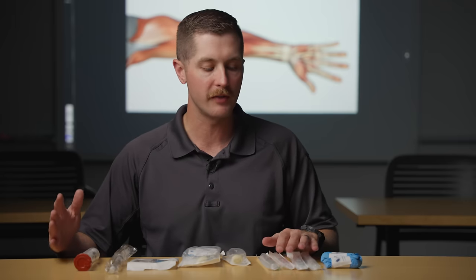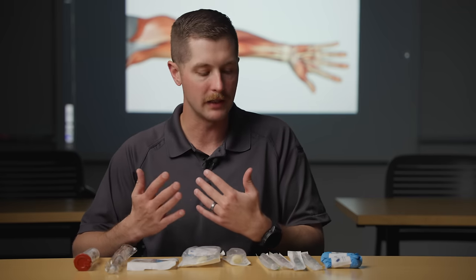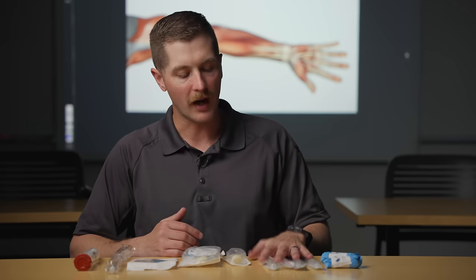If you want to get into large bore IVs you have your 16 gauge and 14 gauge, but those get quite a lot bigger and in my experience unless you have somebody with really large veins they can be difficult to get. Gone are the days of getting bilateral 14 gauge IVs in your massive trauma patients — we're just not doing that quite as much in actual clinical practice. So we've got the catheters here.